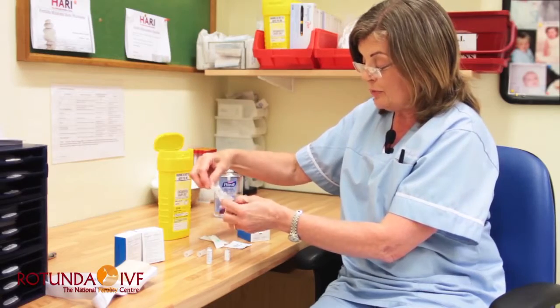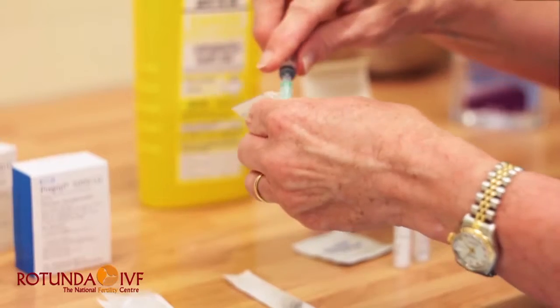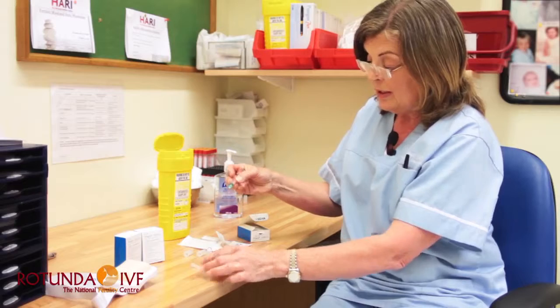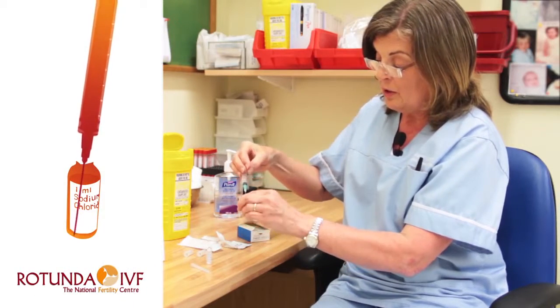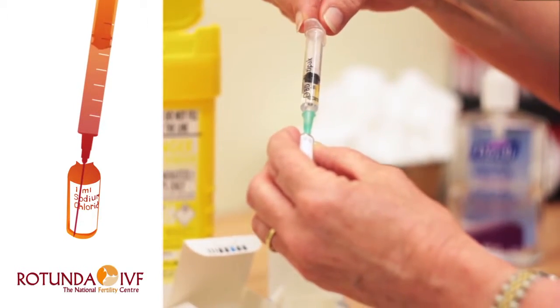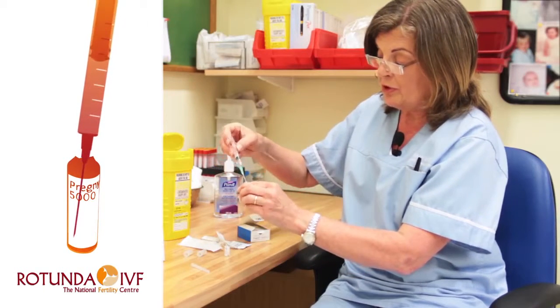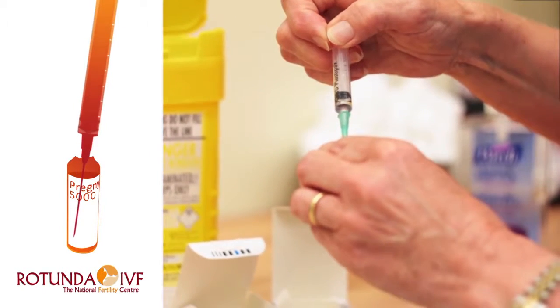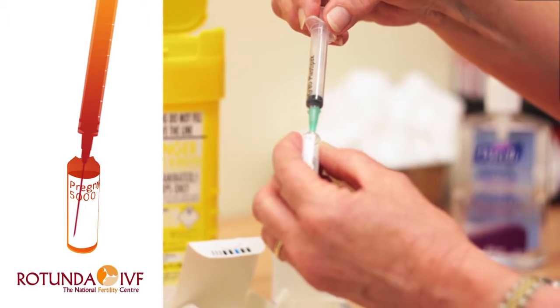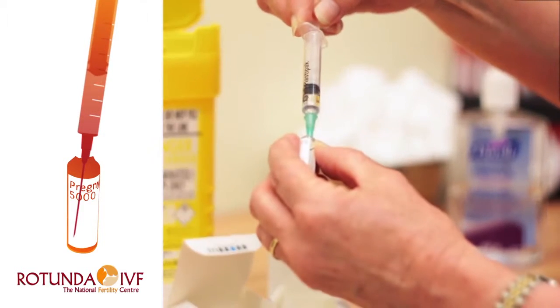Attach the needle to the syringe. This is the long needle we need just to mix the powder and the fluid together. Take the sheath of the needle, insert the needle into the vial of fluid. Inject this fluid into the ampoule of powder. It will dissolve immediately. Now keep your needle in the ampoule and reload it back into the syringe.